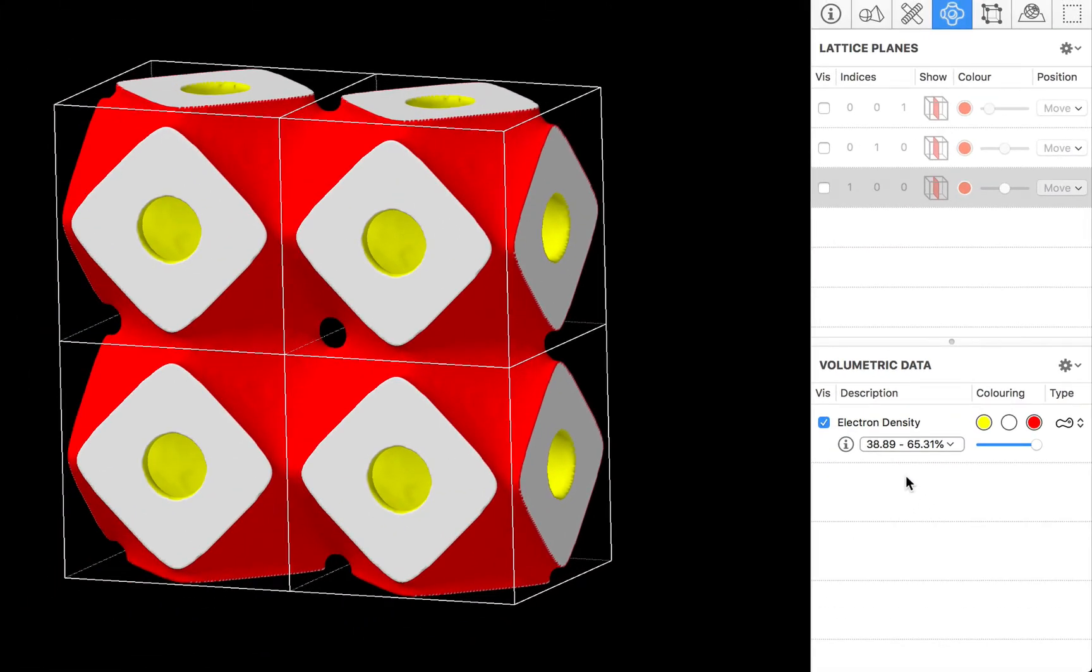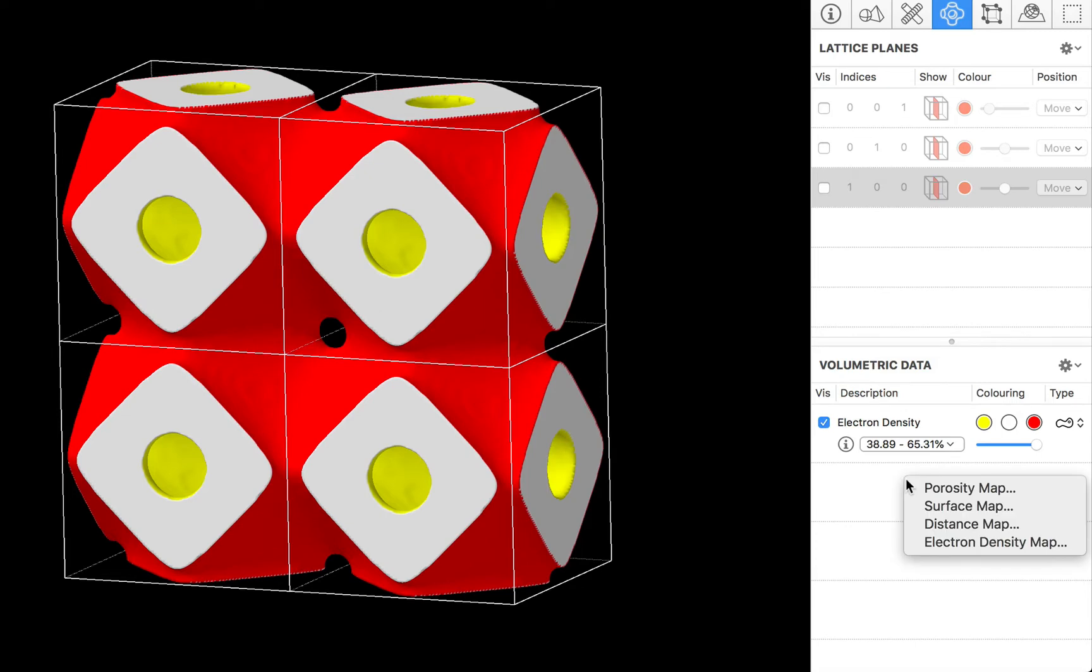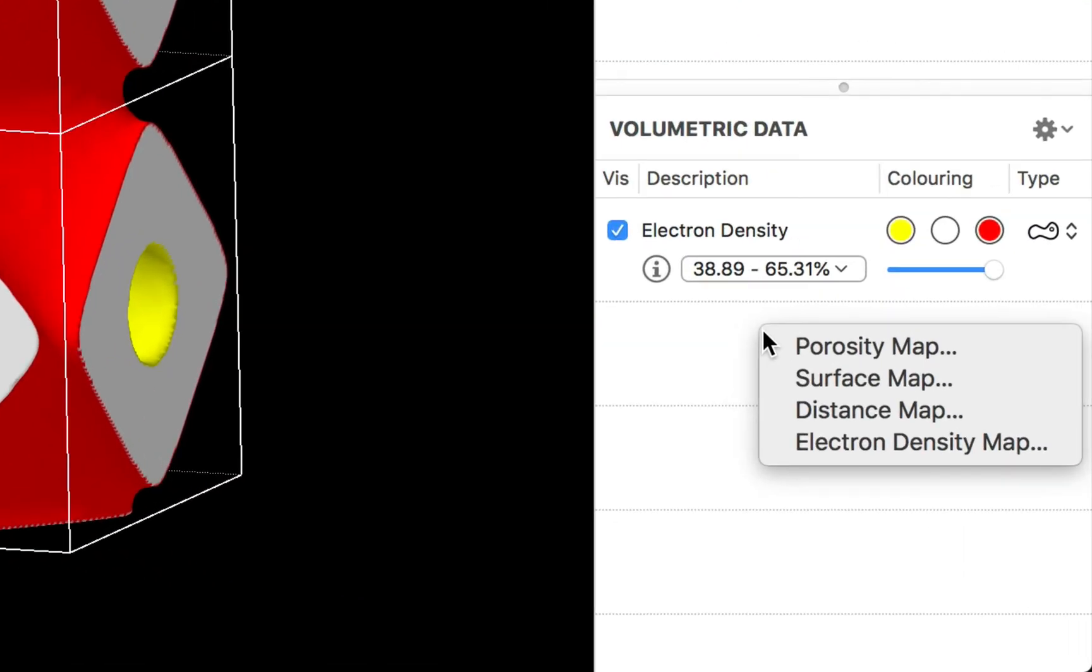Of course you can add multiple data sets to your CrystalMaker document. You're not limited to one and you're also not limited to just our calculated electron density.